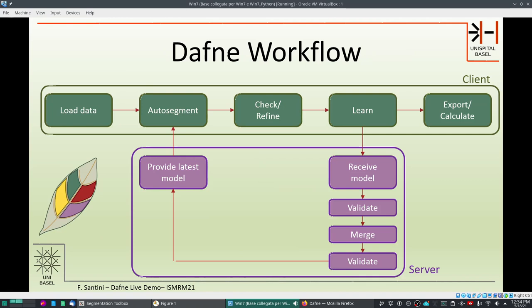The workflow is quite simple. Most of the work happens on the client side in the Daphne program that you download and install on your machine. You load the data and then auto-segment it — though manual segmentation is also possible. The auto-segmentation is performed by retrieving the latest model from our server. Once done, we don't assume the segmentation is good — especially in the beginning when using Daphne on a new class of datasets with a different protocol, performance will not be very good. So you will always have to check and refine the output.